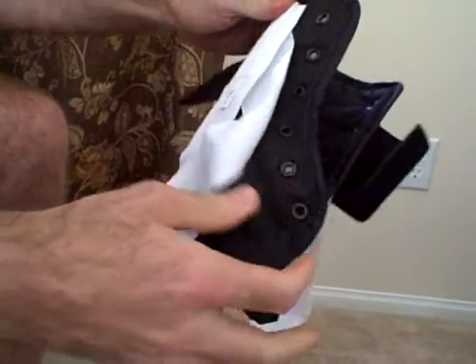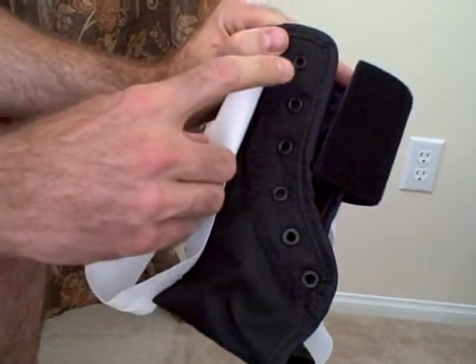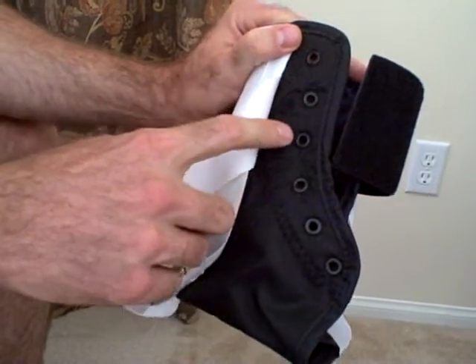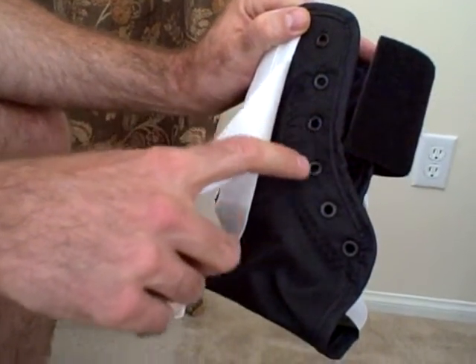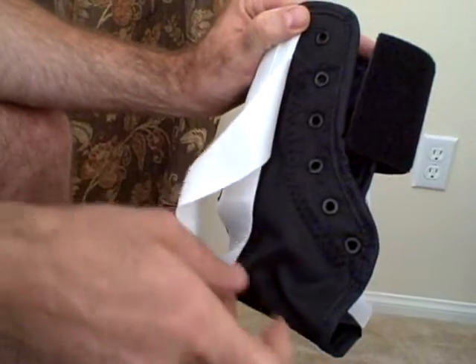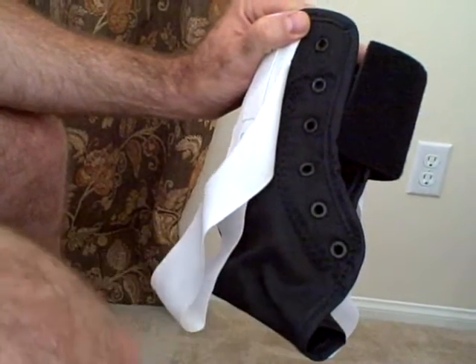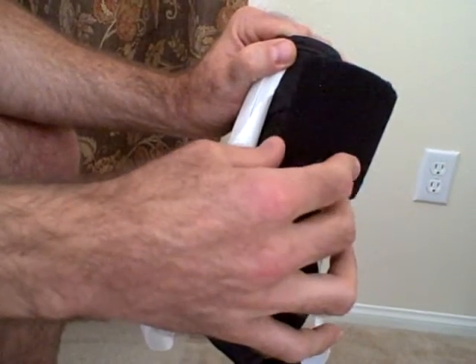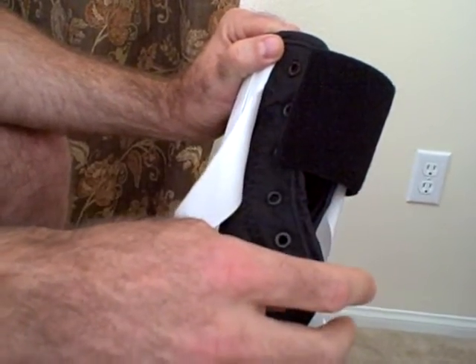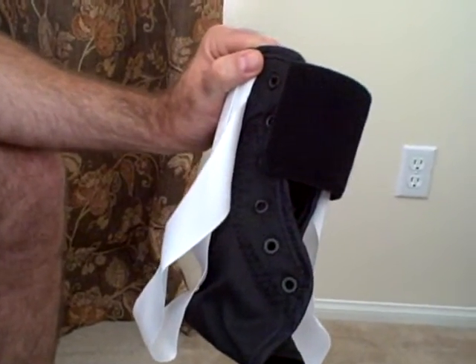The ASO Evo still retains the same construction as the original brace, with the eyelets being evenly positioned down through the front of the brace — seven of them in total. The boot itself is made out of ballistic nylon for enhanced strength, as well as featuring an elastic cuff to close off the front of the ankle brace and cover up all of the laces.